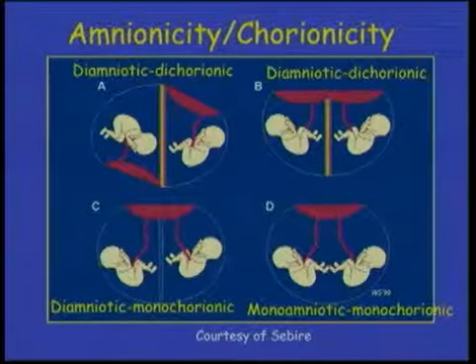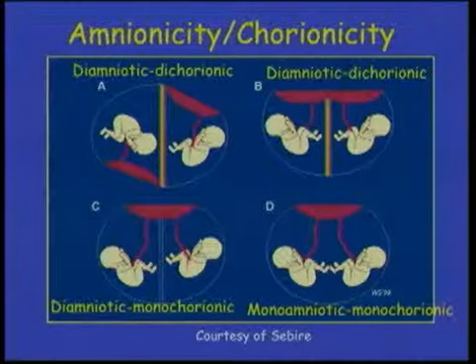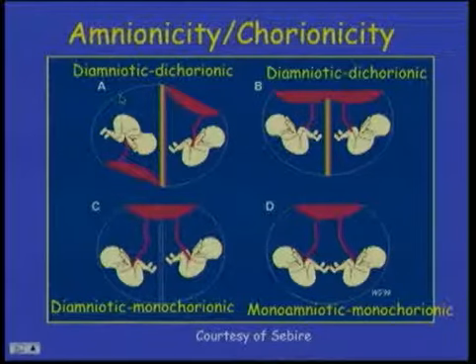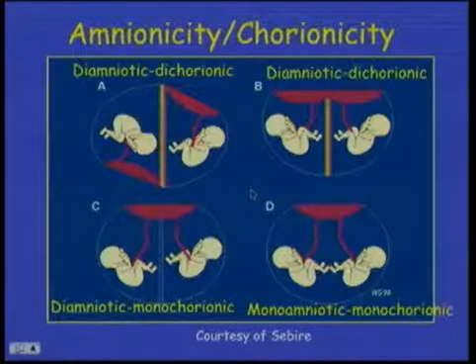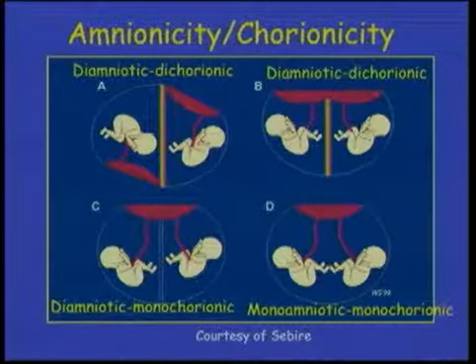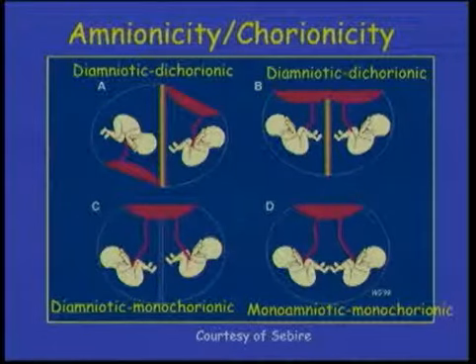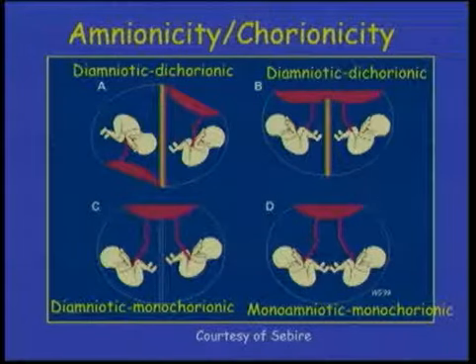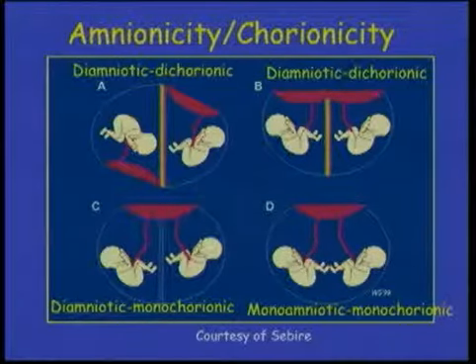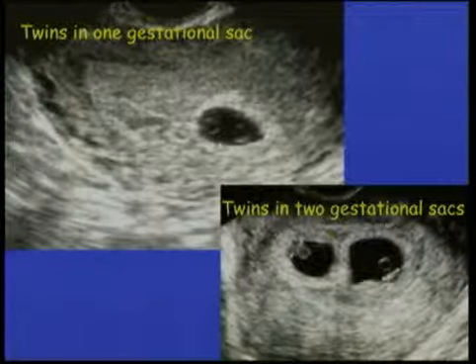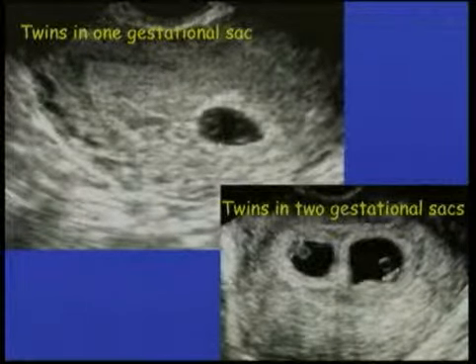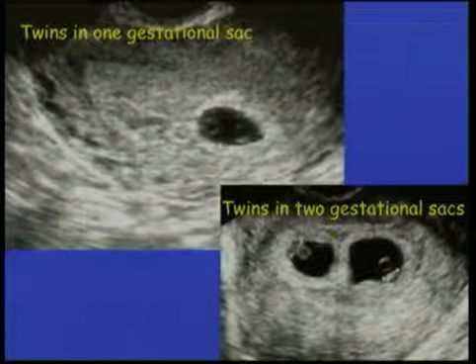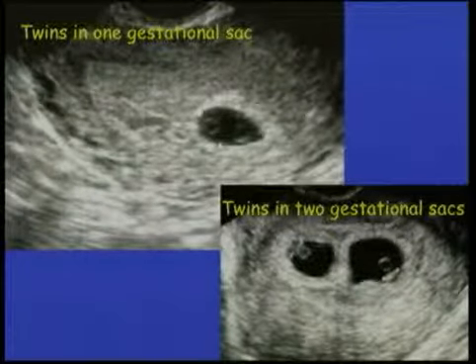The fetal number must be recorded, and the amnionicity and chorionicity should be documented for multiple pregnancies. Amnionicity and chorionicity refer to whether the twins are diamniotic dichorionic — as seen in the upper image A with two placentas and a thick four-layer membrane, or in B with a single placenta — versus monochorionic diamniotic with a single placenta and a thin separating membrane, or monoamniotic monochorionic in D with no separating membrane. In the upper image, we can see a gestational sac with two yolk sacs suggesting an amnion in between, and in the lower right, twins with a very thick separating membrane consistent with diamniotic dichorionic placentation.